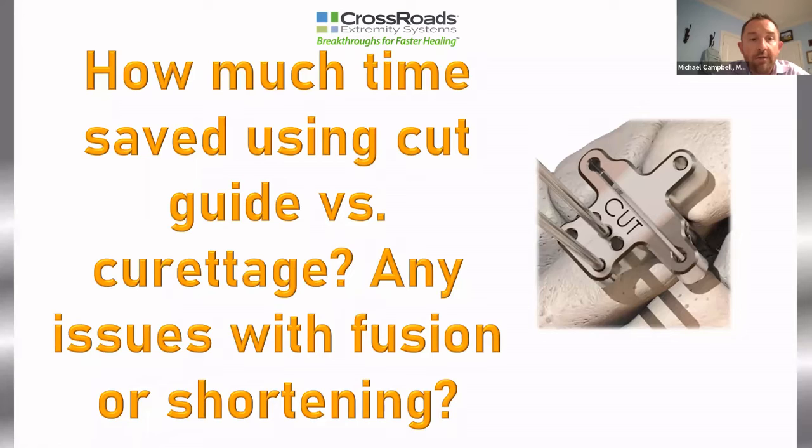I think one of the tricks too, well, we can talk about that later, but it's definitely faster. I would love to say that I'm an incredible surgeon and I can do it better freehand, but I can't do it as fast. I can't do it as well. And when you couple that with the ability to distract because the wires are in place with the Hintermann and prep and then compress, it's a no-brainer. Yeah, I feel like I spent the majority of my time just making sure I got it prepped all the way through to the plantar aspect of the joint.